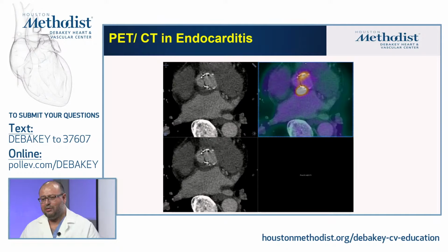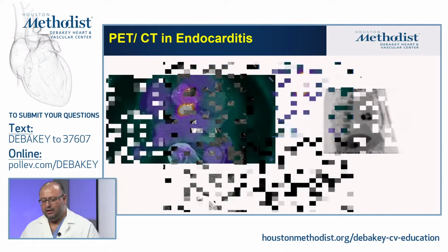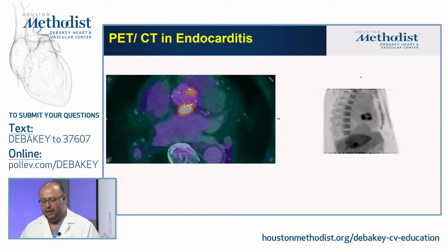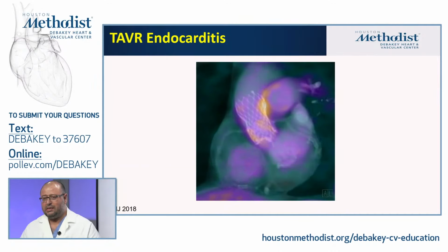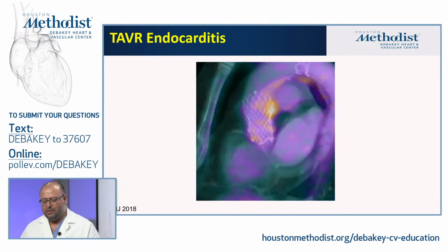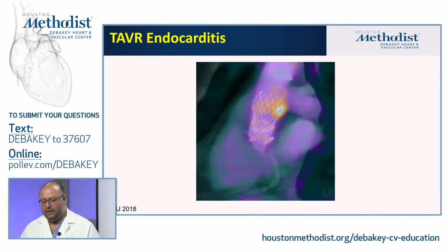It was difficult to image this patient, and you can clearly see that we have, by CTA and by FDG, two suspicious lesions for an abscess. These were confirmed by surgery, and this patient went the same day for surgery and found the same kind of abscesses exactly as they were described here. You can also assess TAVR valves for that, so this is like for prosthetic valves.